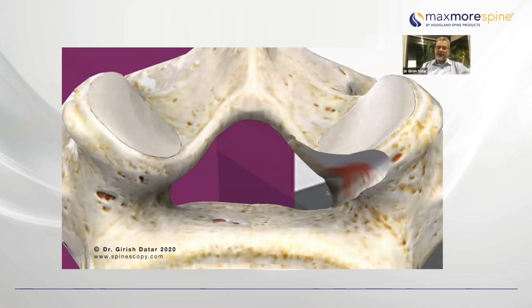So when you put your Tomshidi drills, that is the safe drill, DDM drills, you direct the smooth part of the drill towards the root and the sharp part towards the bone, and you can turn it in a 90-degree arc to gradually go inside and take off this part.